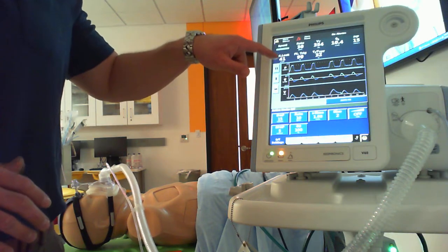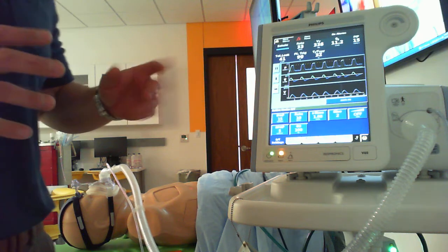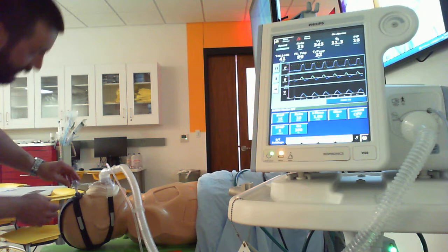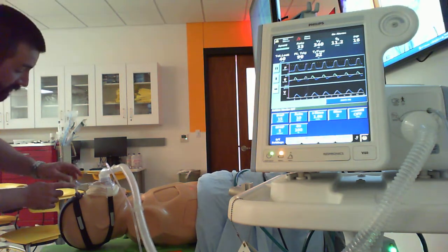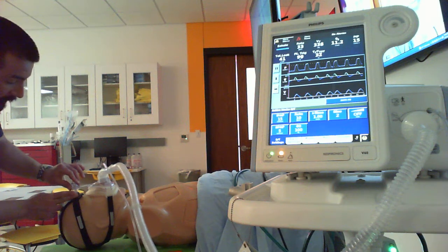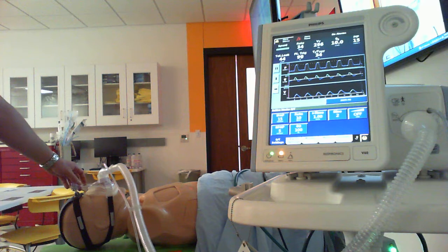Now keep in mind, we do need to reevaluate our leak as we increase this pressure. More pressure in the system, more likely to push air out. So I'm still in an appropriate leak value, but if I could snug this mask up a little bit, there's a little fine-tuning adjustment knob that puts a little bit more pressure on the bridge of the nose. I'm going to hit that button and make a little bit of a better seal and see if that brings that down some. Actually made it a little bit worse.